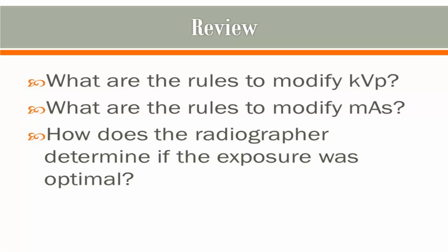I hope you found this information to be helpful. If you have any difficulties understanding these concepts, please seek additional instruction from one of the faculty. Knowledge of these concepts is essential to choosing proper technique selection in the clinical setting and protecting our patients from habitual overexposure, known in the field as dose creep.